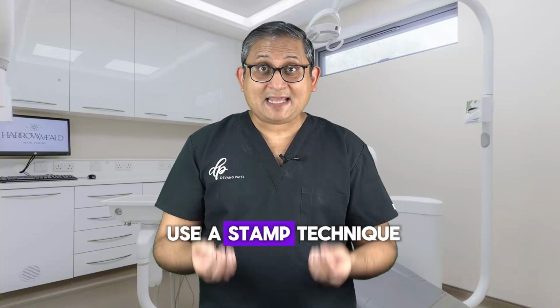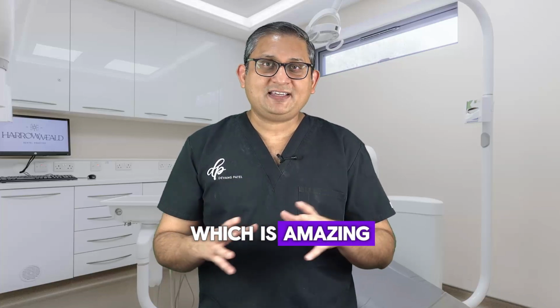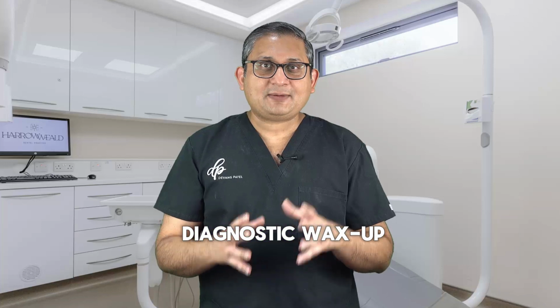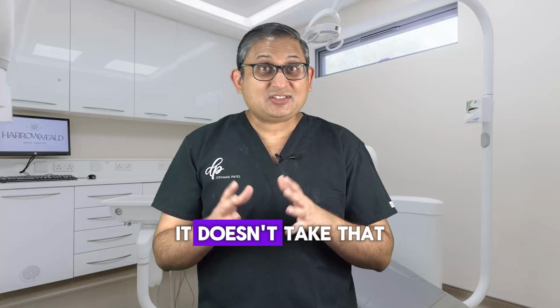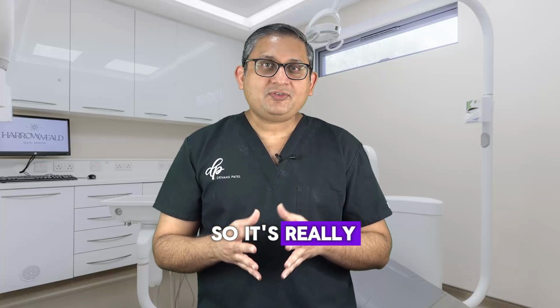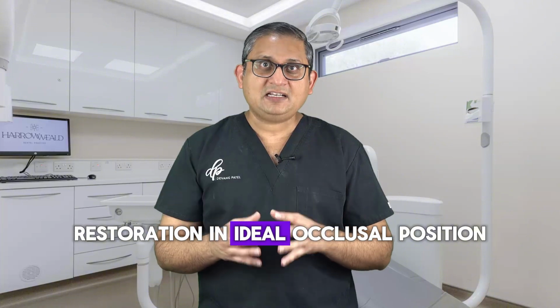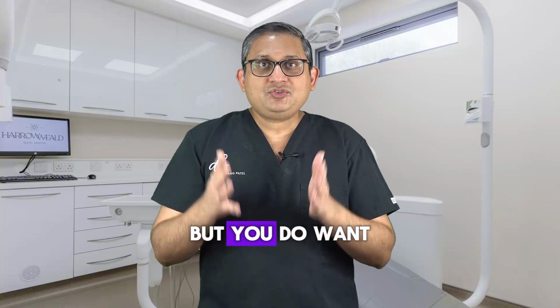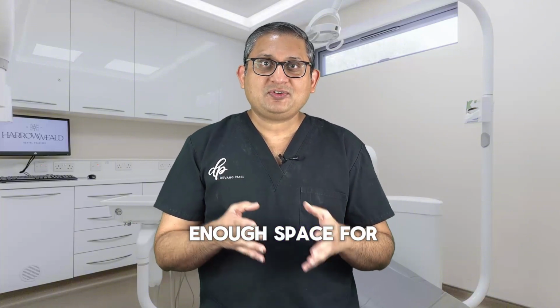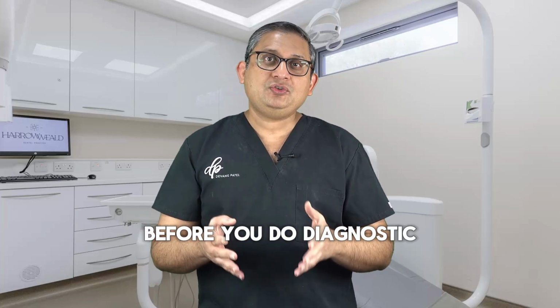Are you going to use a stamp technique, which I teach in my FMR courses, which is amazing. Once you've done the diagnostic wax-up and you've got the stents ready, it doesn't take that long, probably 15-20 minutes per tooth. So it's really quick and easy to do an occlusal coverage restoration in an ideal occlusal position. But you won't know whether you have enough space for indirect restoration or direct restoration before you do the diagnostic wax-up.